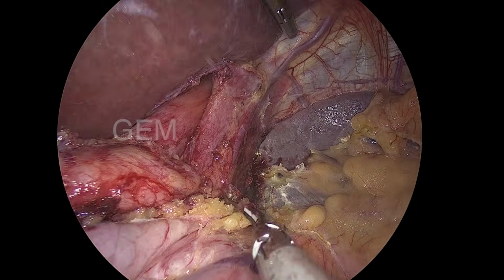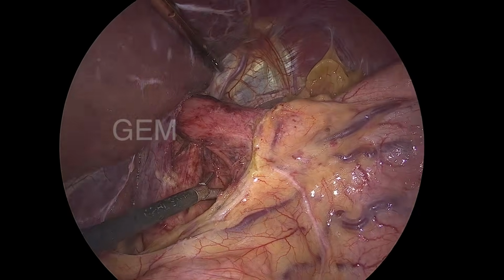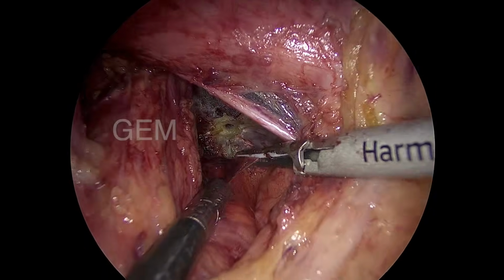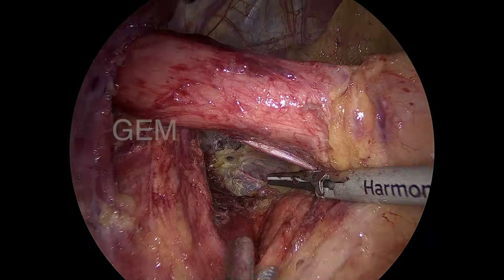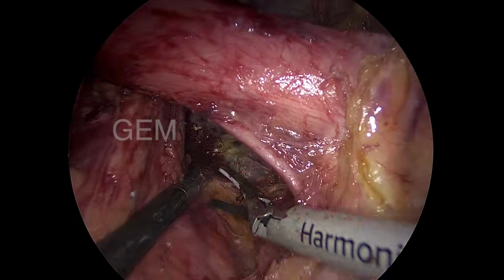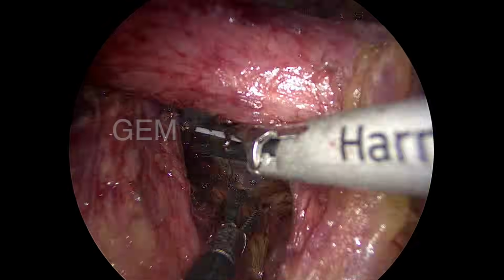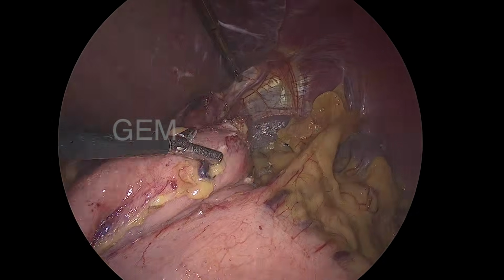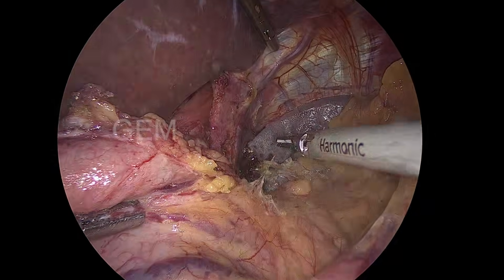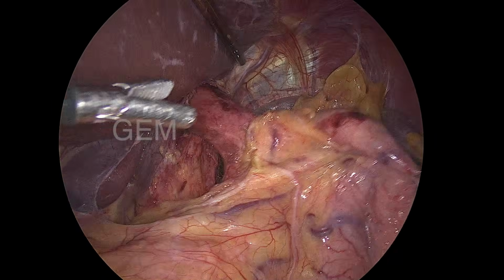So once you see the entire left side crus, let us say the left pillar of the right crus, then your dissection is completed. Your mobilization of the fundus is completed. If you find it difficult on that side, you can do it from this side. Some more attachment is there. So if it is necessary, we will divide that attachment.